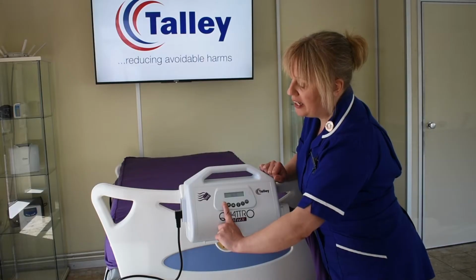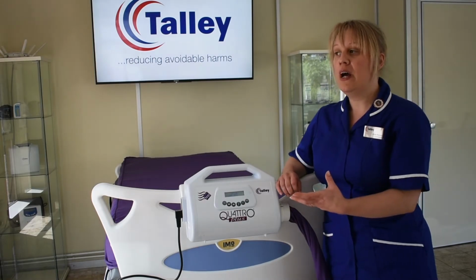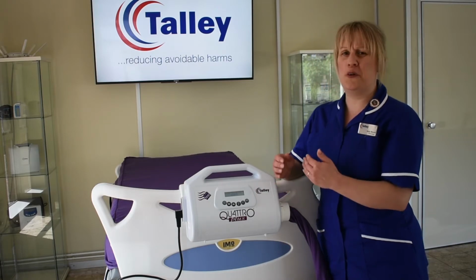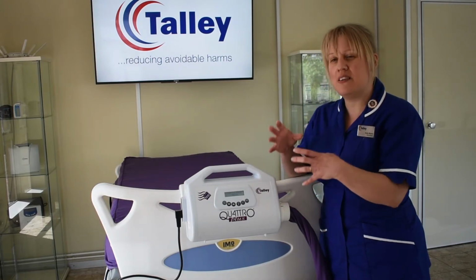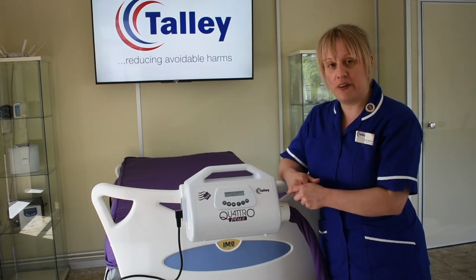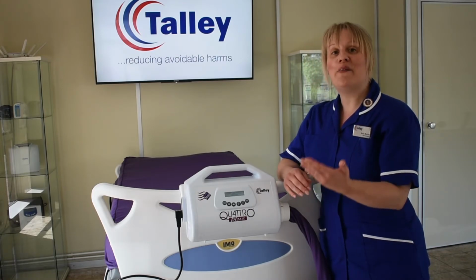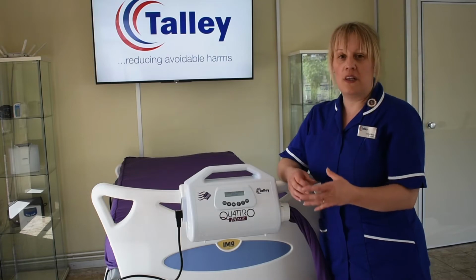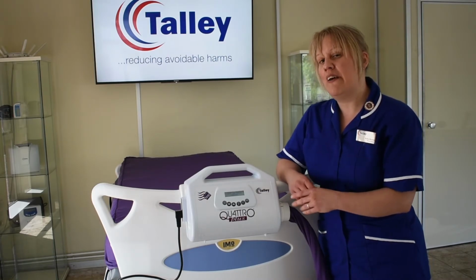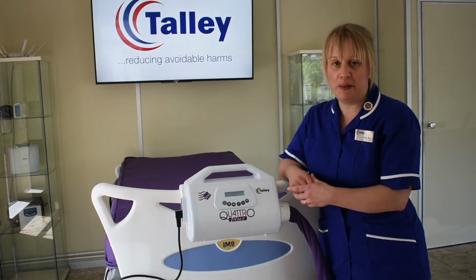And it will change it back to active mode. Like I said, continuous low pressure is a soft static mattress that you may use if your patient is, for instance, palliative or end of life, and you don't want them to be moved onto another surface, but you don't necessarily want them in that active mode anymore. So you could just step them down onto continuous low pressure at that point. It also might be that your patient is improving, and before you step them down onto a foam mattress, you just want to make sure that the patient can tolerate that type of static surface. Or it could just be that they're a little bit oversensitive to that 1 in 4 cell cycle, in which case continuous low pressure may be the next best option.